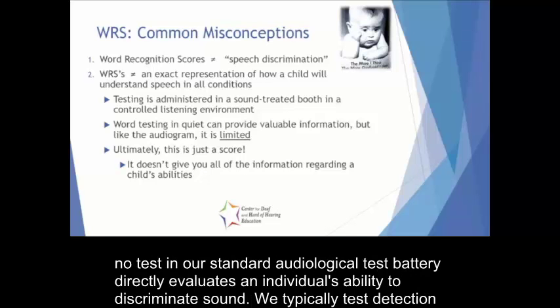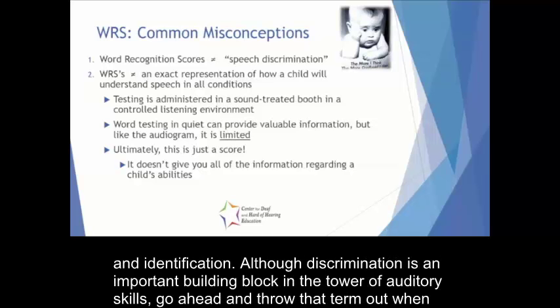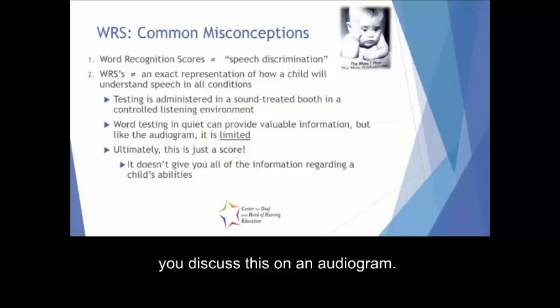In fact, no test in our standard audiological test battery directly evaluates an individual's ability to discriminate sound. We typically test detection and identification. Although discrimination is an important building block in the tower of auditory skills, go ahead and throw that term out when you discuss this on an audiogram.